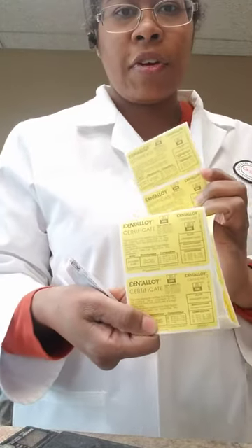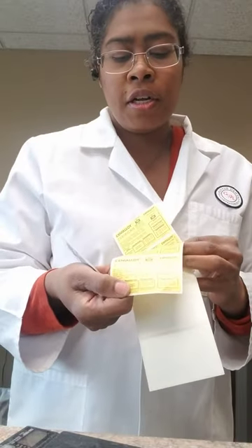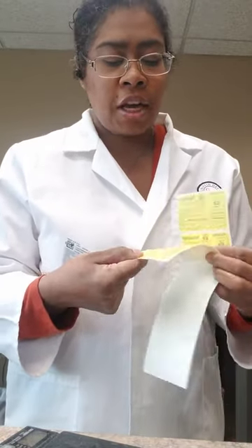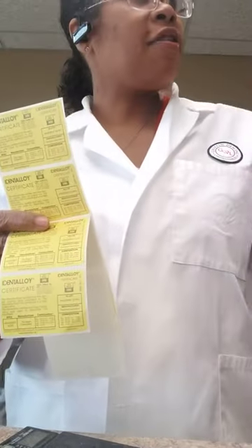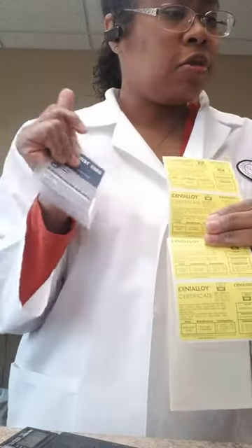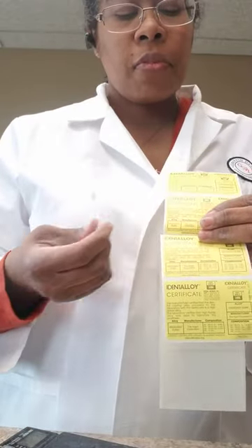Argent is one of our manufacturers, and they actually come with Identalloy certificates, which is kind of fun to have when we send out cases. It tells us exactly what alloy we're using on each case. For instance, this is one of the cases I have, and this is the alloy I'm going to use on that one.